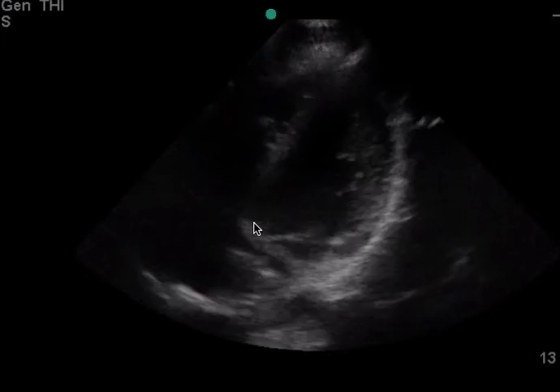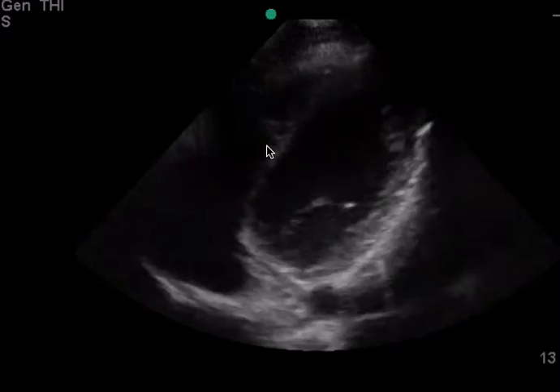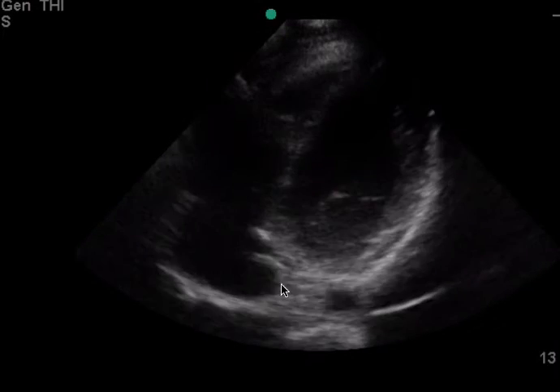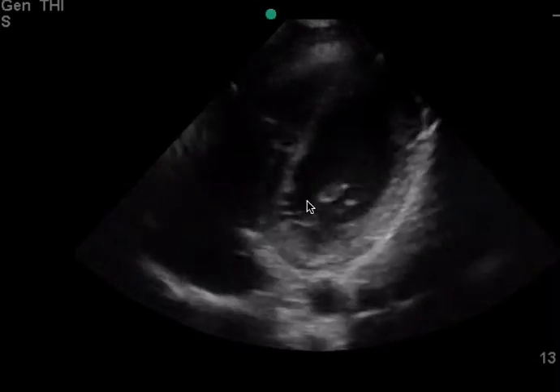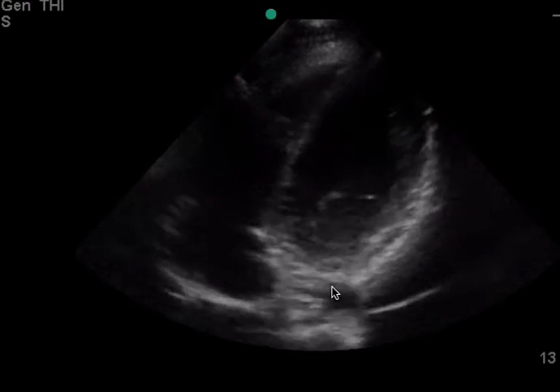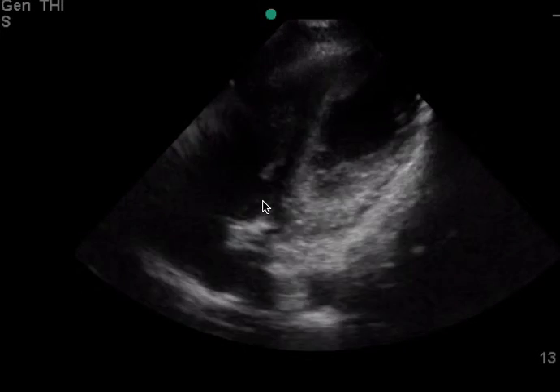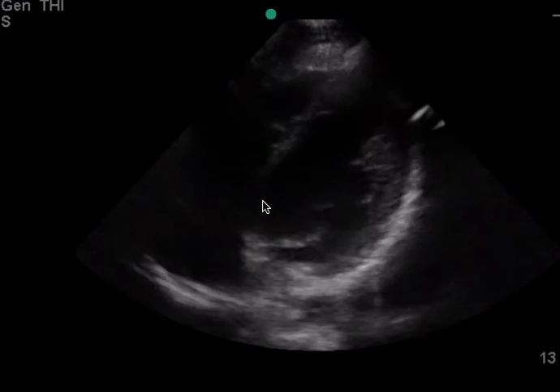And then your final image is here. It looks like you're trying to get an apical 4. But again, a little bit oblique because you can't see the left atrium, but enough where I can make the clinical decision that the ejection fraction is normal and there is no fluid behind the descending aorta. Difficult to tell about the RV if there's any strain, but for the most part, I think it answers all the questions.